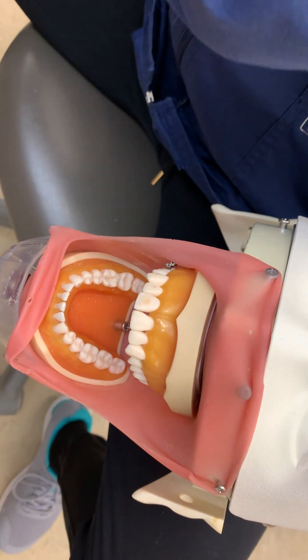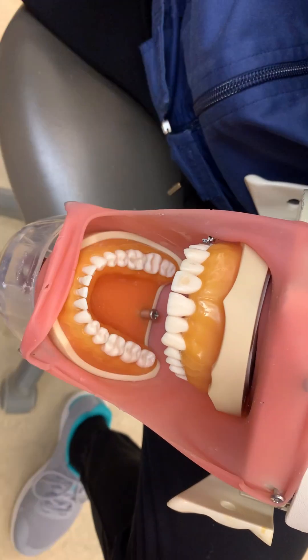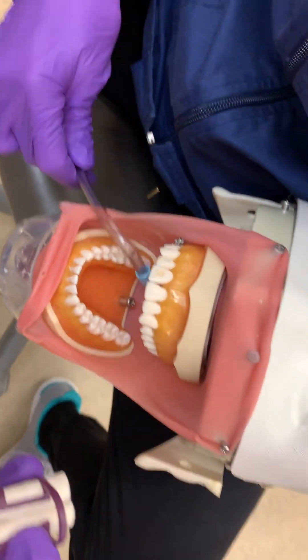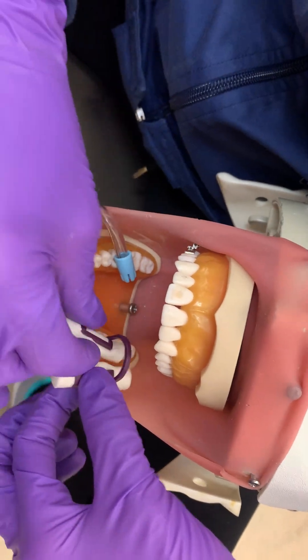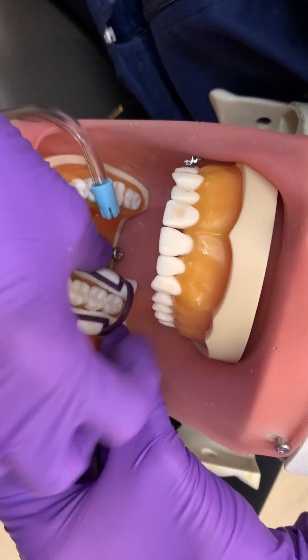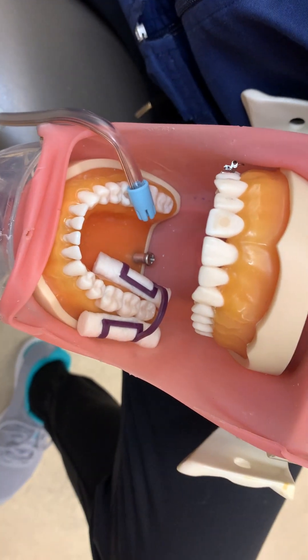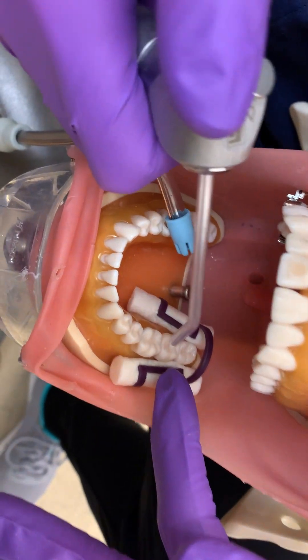We are going to isolate the selected area for maximum effectiveness and client comfort. Today, Monica is using a Garmer type clamp with two cotton rolls. If we were working on the maxilla, we would use a dry angle to isolate the parotid gland. She's going to check the placement of the cotton rolls in relation to the hard and soft tissues, insert the saliva ejector, and then dry the occlusal thoroughly.